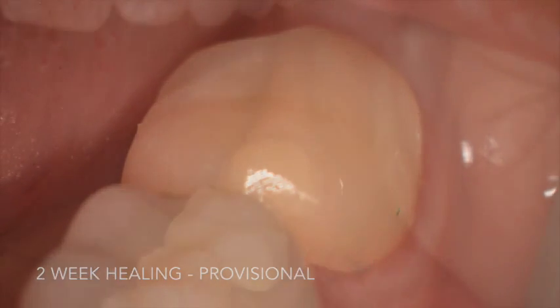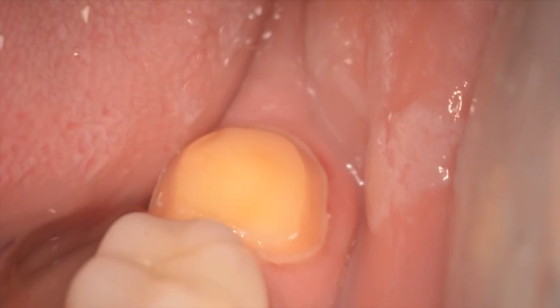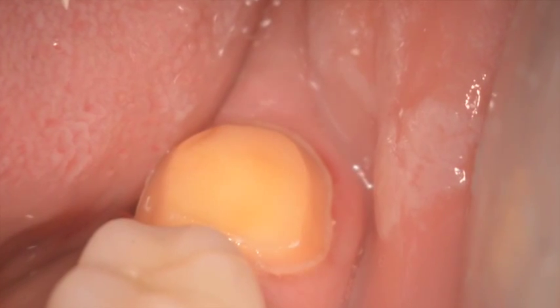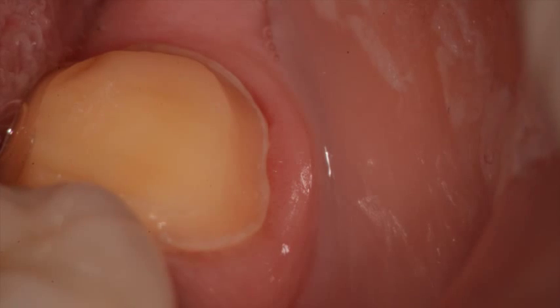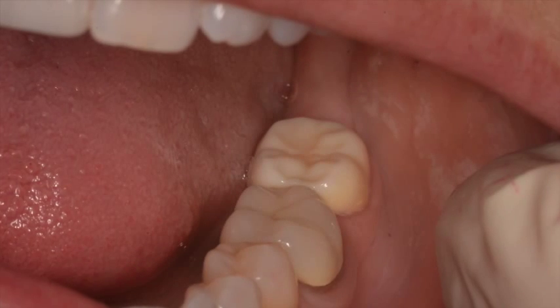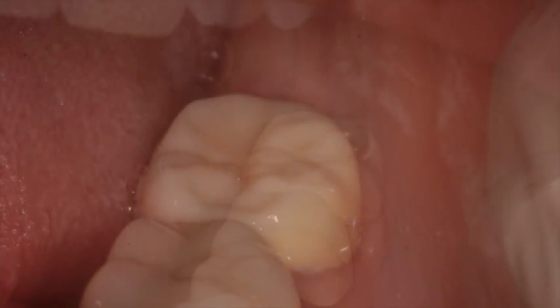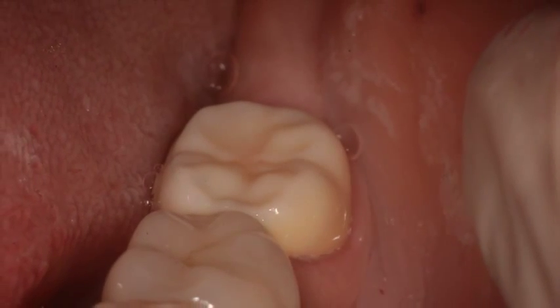Note the healing when you remove the provisional two weeks later — first at low magnification, and as we increase the magnification, how clear it is and the tissue is healing beautifully. The patient had no post-operative discomfort, and you can see the full contour zirconia crown — it's much stronger than an Emax — that has been cemented in place.